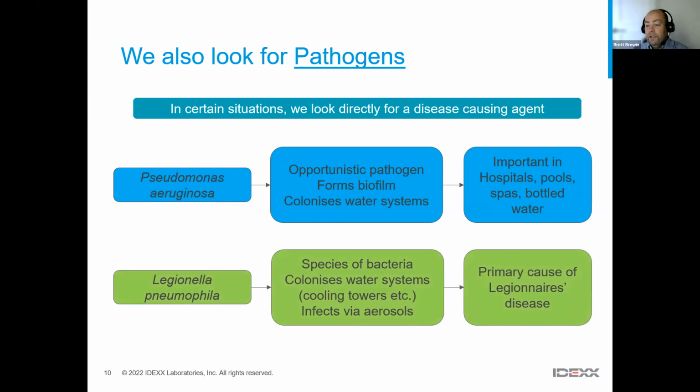Legionella pneumophila is another pathogenic bacteria, which causes Legionnaires' disease, as I'm sure you all know. And it's very good at colonizing water systems, cooling towers, and anywhere that you're going to generate aerosolized water particles. Legionella pneumophila is extremely important.